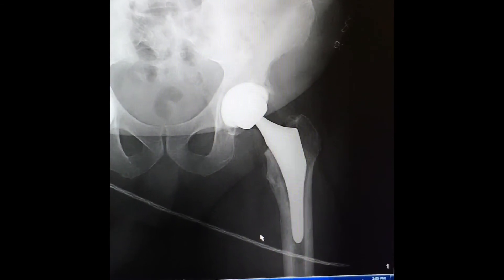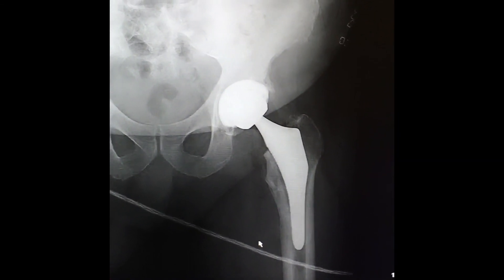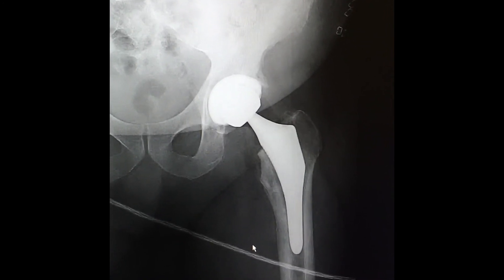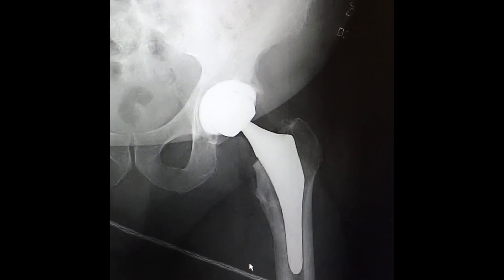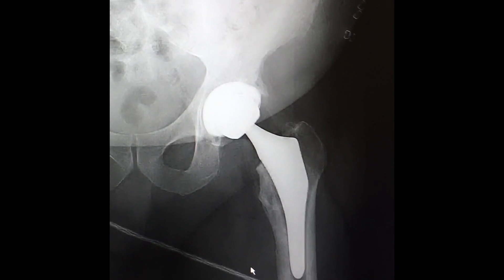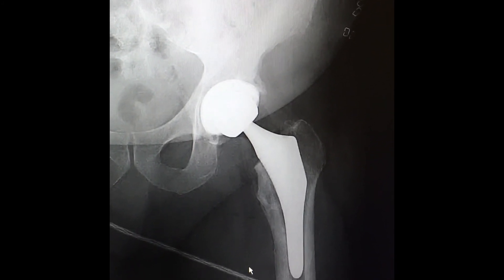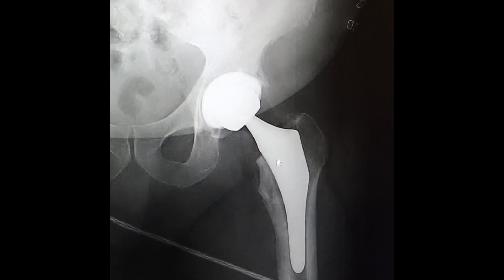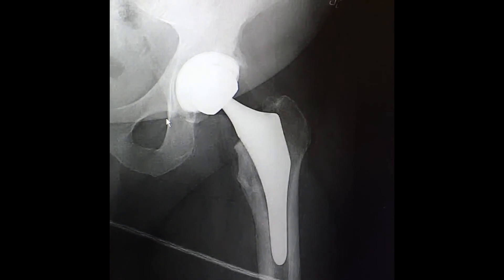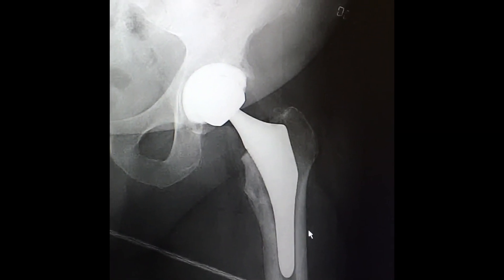This is our immediate post-op x-ray from the Mako robotic hip replacement that we planned this morning. Although these x-rays are somewhat technically limited, you can see excellent positioning of the implants. We're extremely satisfied with the position and also with the fit of the implants — both the socket that you see here and the femoral stem.